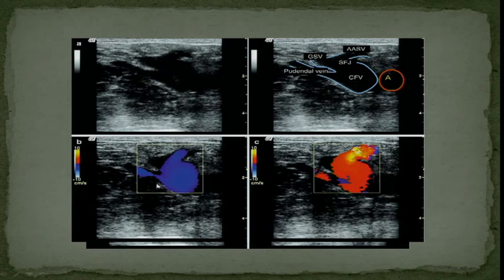This is the same patient. This is without Valsalva. This is with Valsalva. So while they are doing the ultrasound exam on the patient, they have to keep an eye and immediately freeze when they see red. Any of you who have done these venous exams will understand sometimes reflux is only momentary. When you do the Valsalva, there's reflux, the patient relaxes, reflux goes away. So you have to capture the moment. She has to hit the freeze button when she's acquiring it.